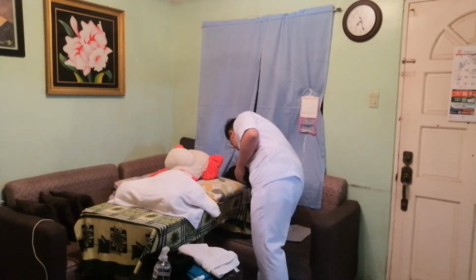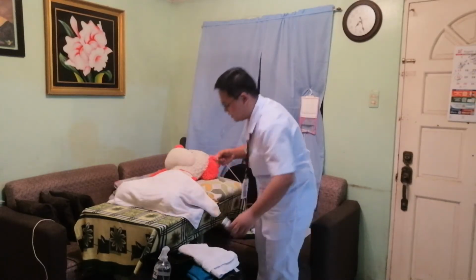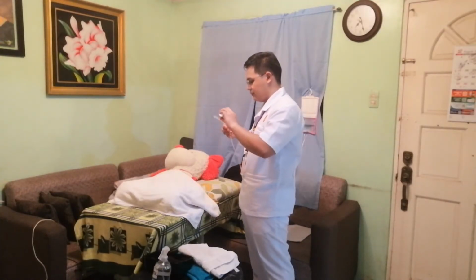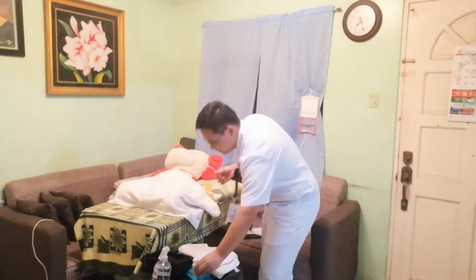So for our implementation phase, the first thing that we need to do for our preparation is to lubricate our rectal tube for about 5 centimeters or about 2 inches. Okay, so for example, this is our water-soluble lubricant. We're about 2 inches. We need to put it. Okay, and we need to remember not to touch the lubricated part of our tube.